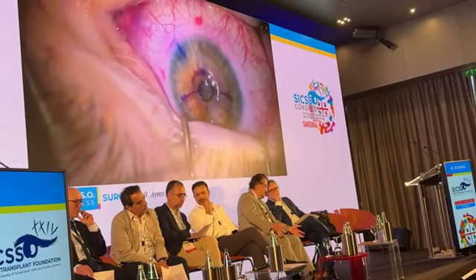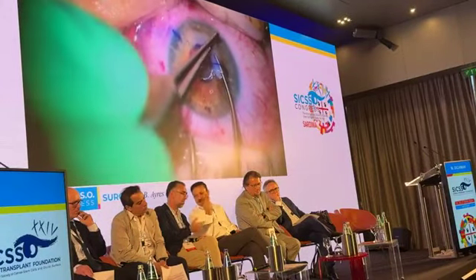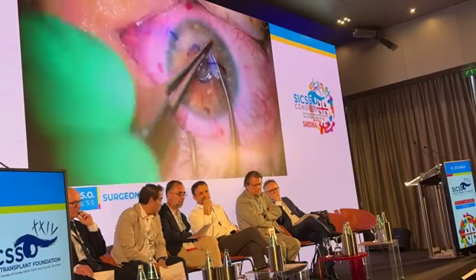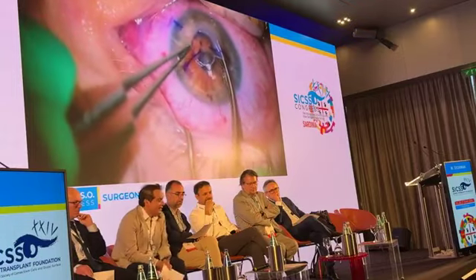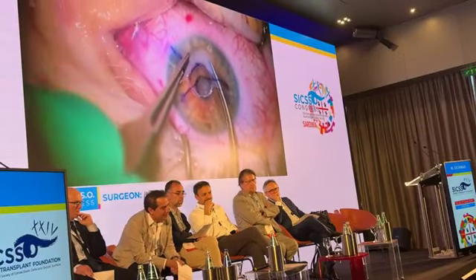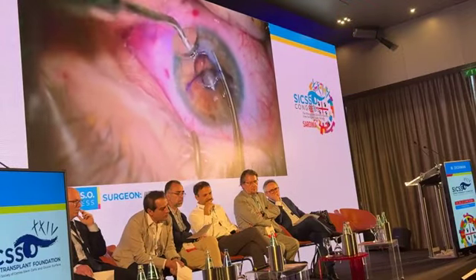Okay, I'll take the forceps again. And now we'll try and get the channel the rest of the way in. But as we push, we're going to want to let this extend out. And this is about as thick as the segment's going to get at 500 microns. So you can see it's like pushing a little inchworm into the eye, and as it goes in, we're going to smooth it out for him. I'll take that little smoothing ball again. We're just going to work this around.